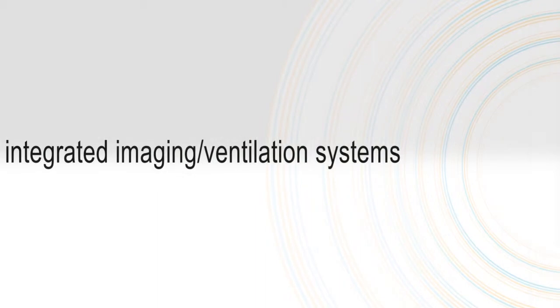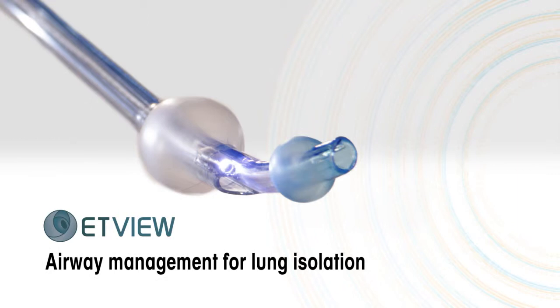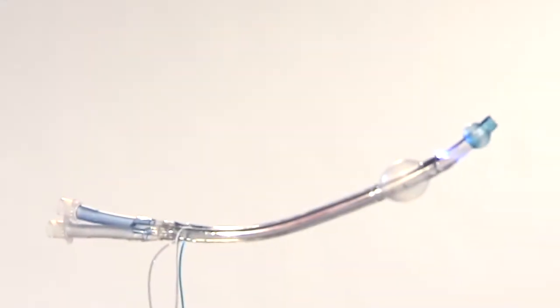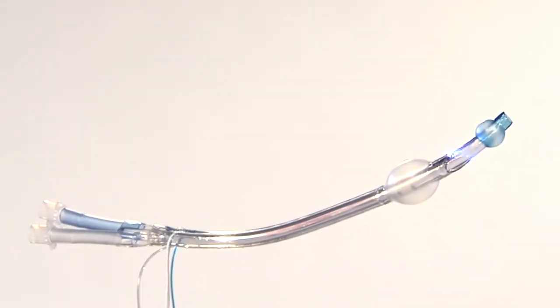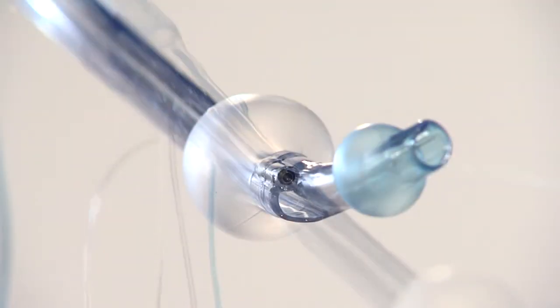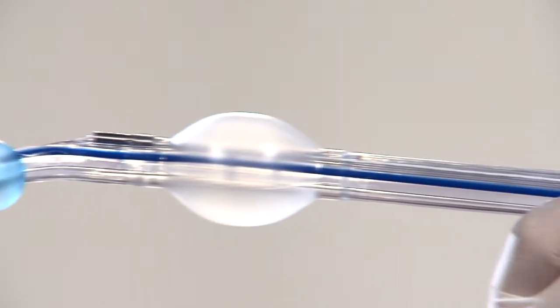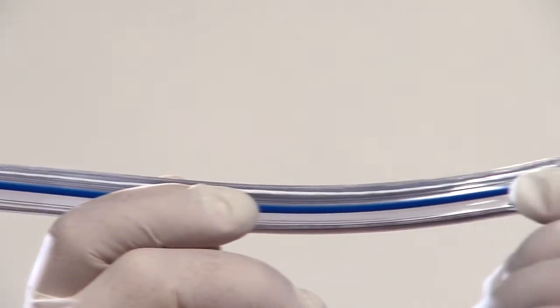See the possibilities when you use the VivaSight product portfolio of fully integrated imaging ventilation systems. ETView introduces the VivaSight DL, a sterile single-use double-lumen airway tube with an integrated high-resolution camera used in lung isolation and left-right thoracic surgical procedures.